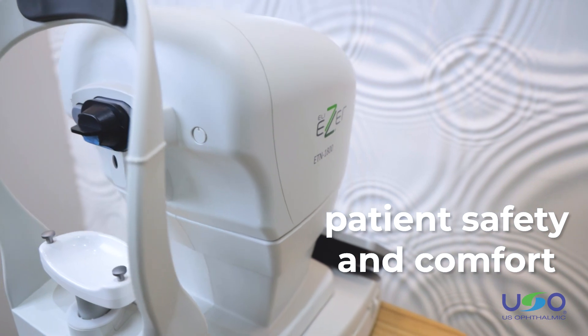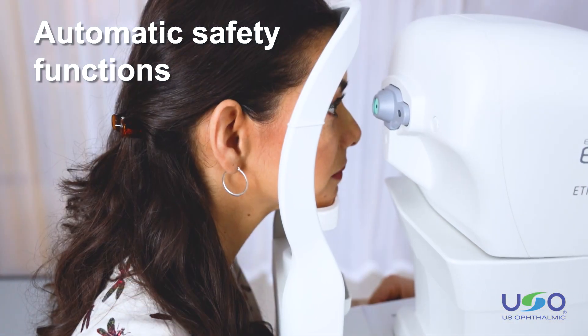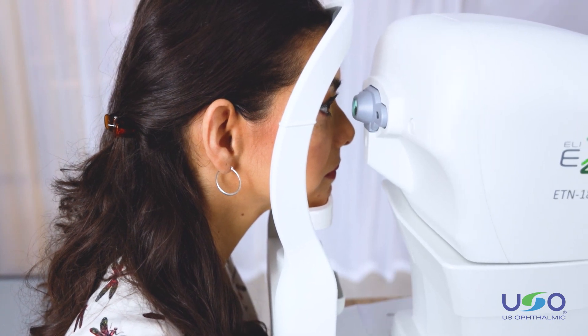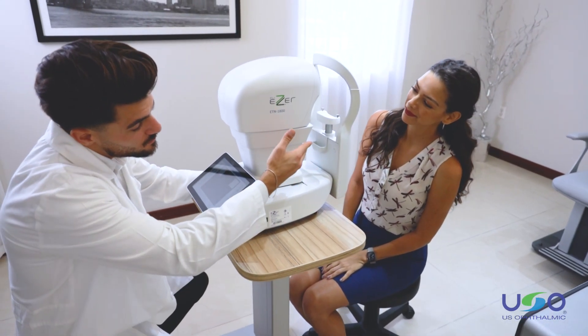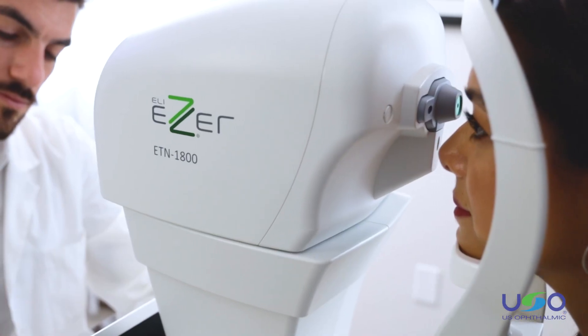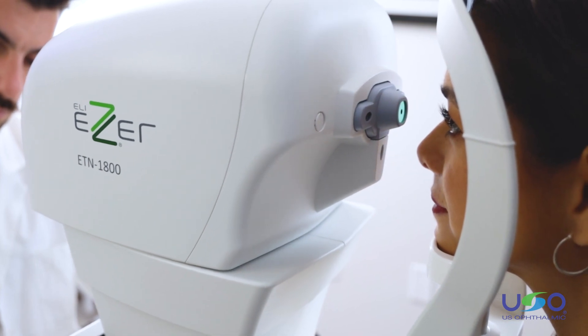With patient safety and comfort in mind, Ezer has added automatic safety functions to stop the equipment if the tonometer comes too close to the patient's eye. A test puff option has also been incorporated to prepare and show the patient what the eye pressure measurement will feel like, so the patient knows what to expect and can better prepare and relax at the time of actual measurement.